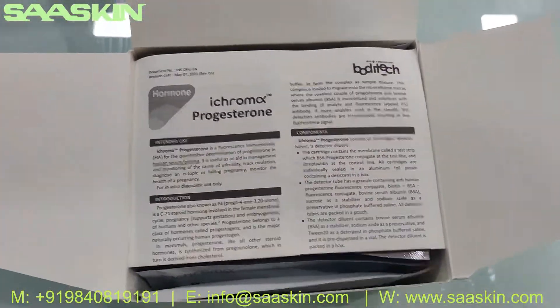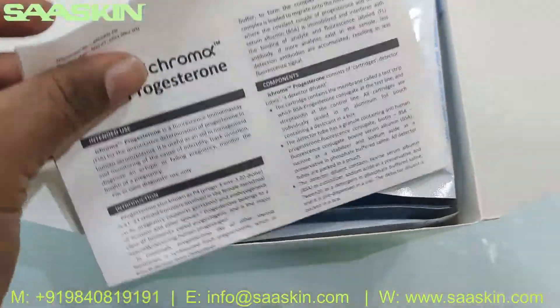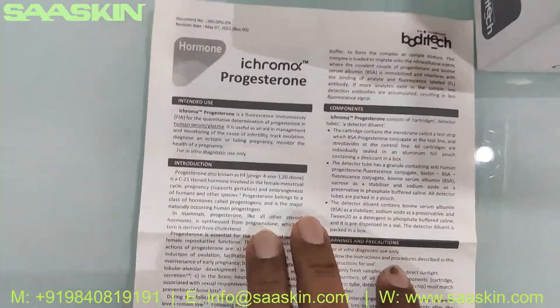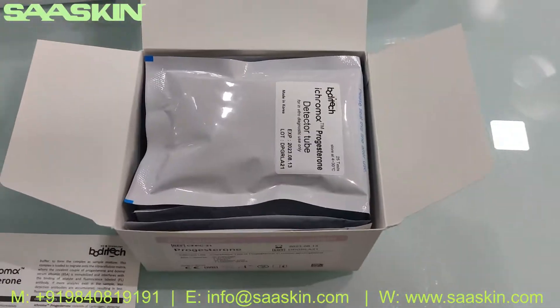I'll just open this box for you. Inside the box you've got an IFU brochure and instruction for use — a complete manual for completing the total test using the iCHROMA2 analyzer. This kit has to be used with the iCHROMA instrument.